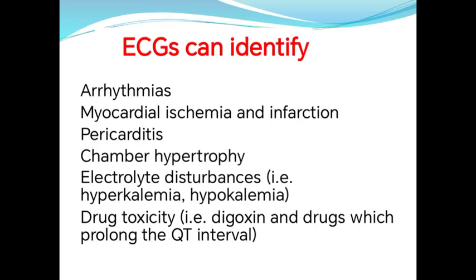Arrhythmias like tachycardia, ventricular tachycardia, or supraventricular tachycardia, and even tachy- or bradyarrhythmias like heart block. We can use the ECG to diagnose these problems.